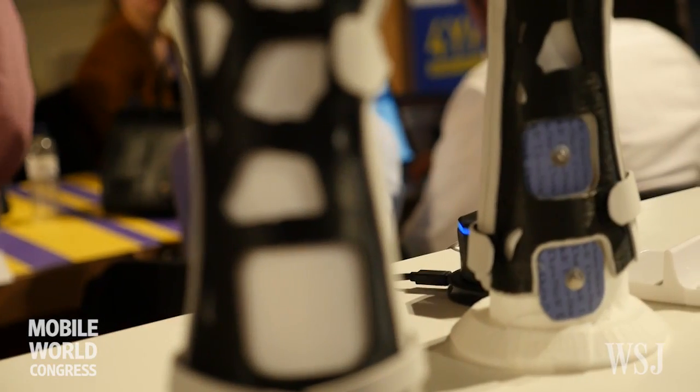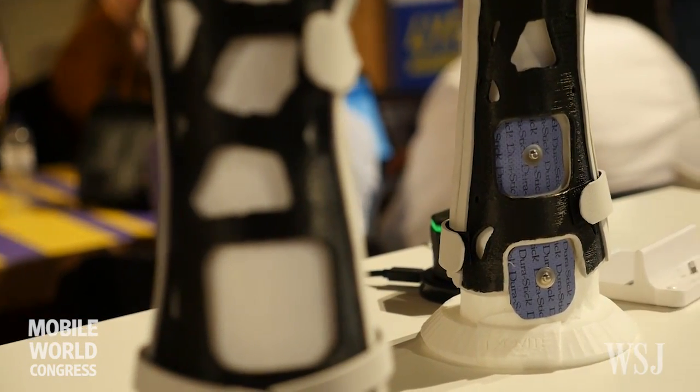Each cast costs 150 euros, and each day using our electro-stimulation device in the patient's home costs 10 euros.